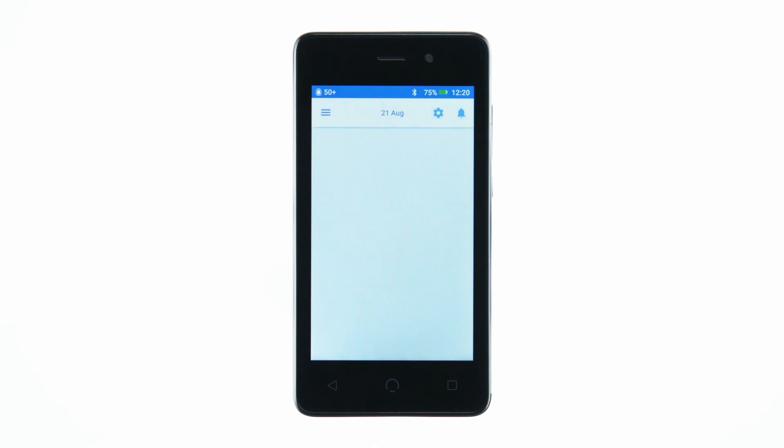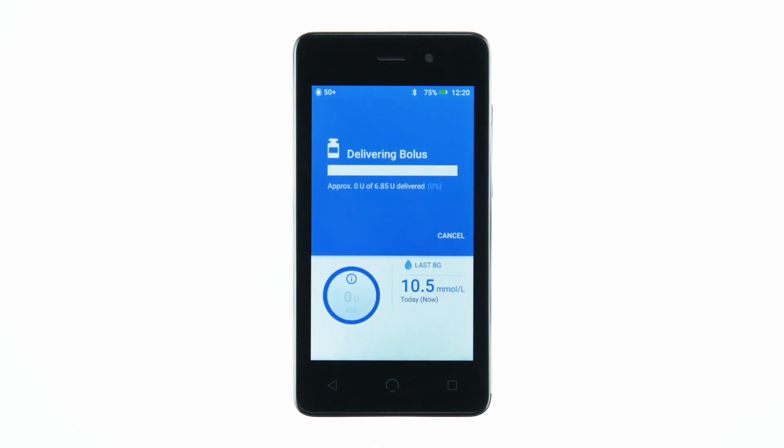While the bolus is delivering, you will see a progress bar. You may choose to cancel the bolus while it is still delivering.